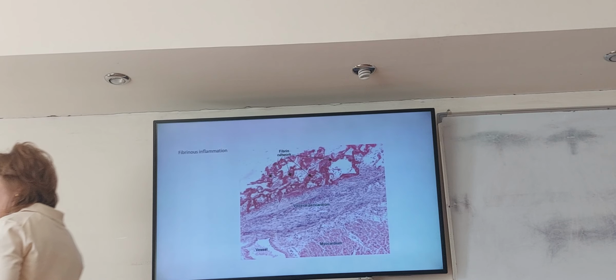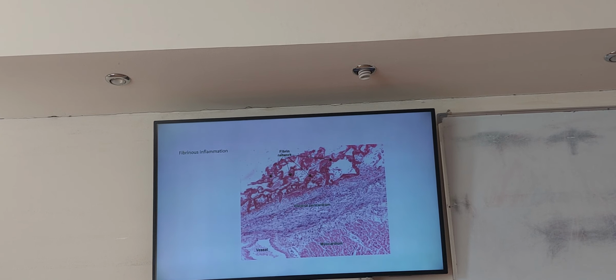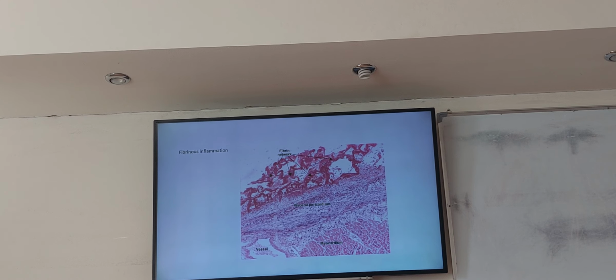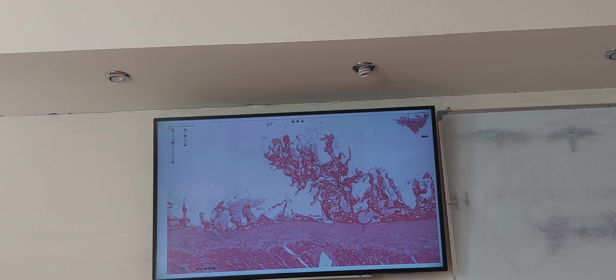Number 3, what is this? Fibrin. What does it mean? Fibrin network. It means I have increased permeability for fibrin to go out of the vascular walls, and I will see it in the form of a network, an eosinophilic hyaline meshwork. Now, this meshwork, where do I see it? Give me examples.